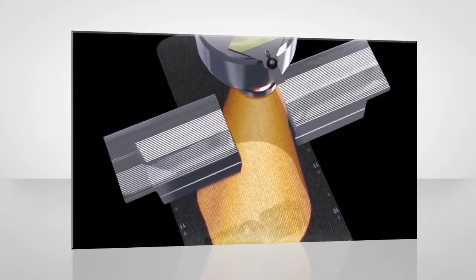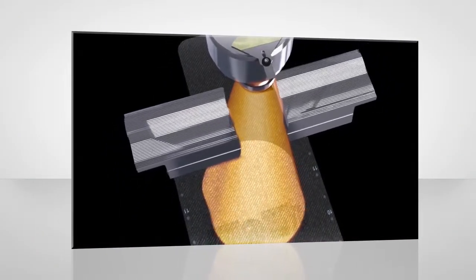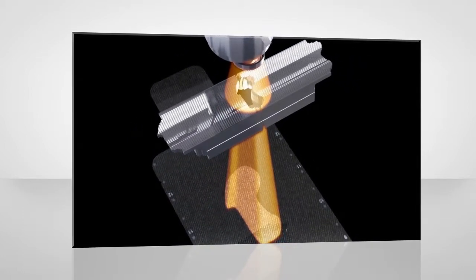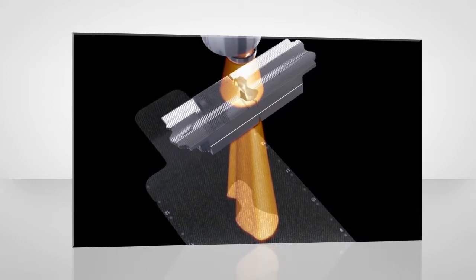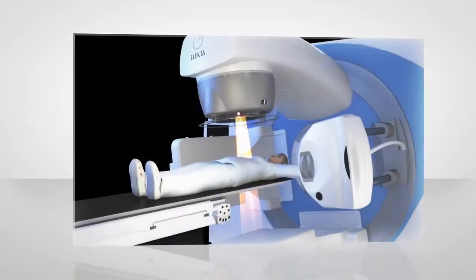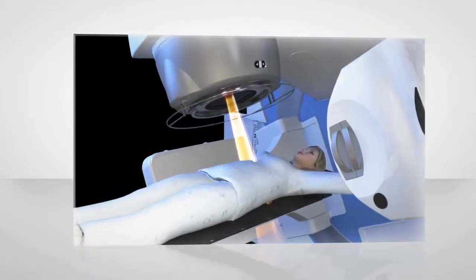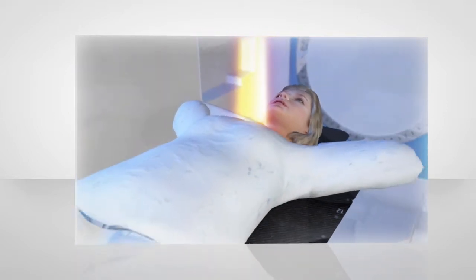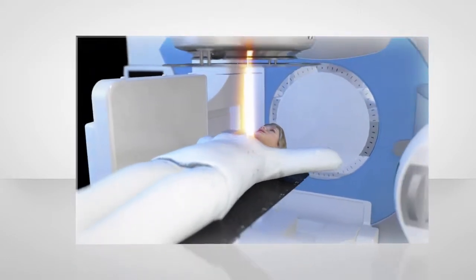So the precision and the short amount of treatment time are huge advantages. SRS has become an increasingly attractive alternative to open surgery for treating brain and spine tumors because very intense and precisely focused radiation can be delivered to small, localized tumors while sparing the sensitive surrounding tissues and structures. Typically performed in 1 to 5 treatment sessions, this approach allows highly accurate and effective treatment that is minimally invasive, which means less disruption to your life.